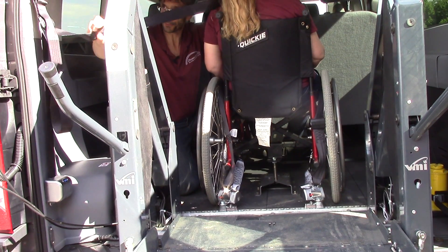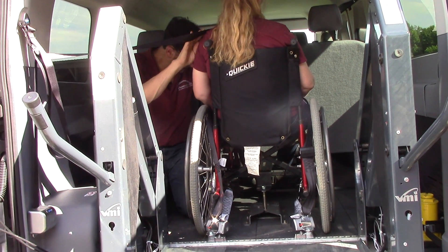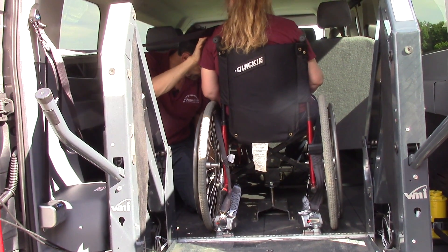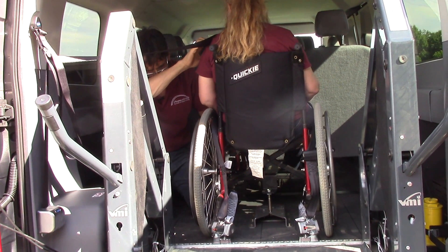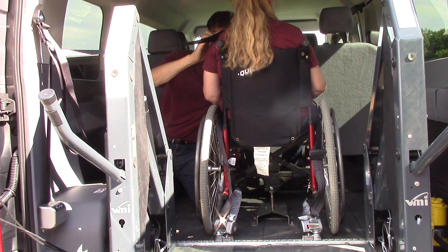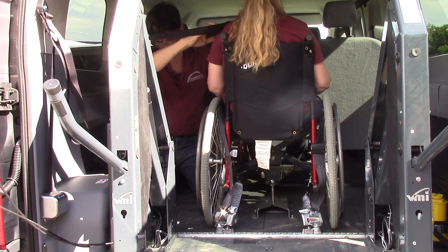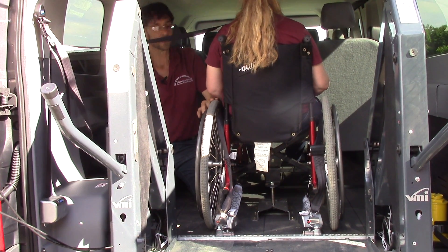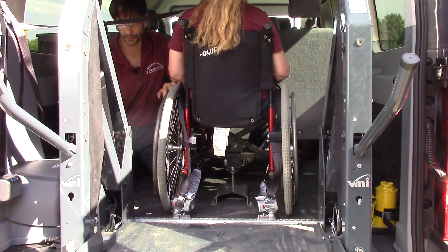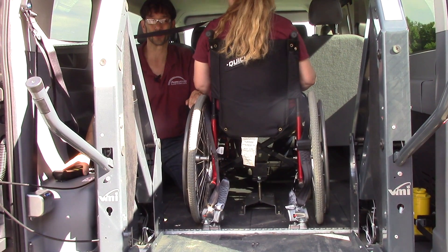Make sure that it goes properly over the shoulder and we're ready to go. You'll notice that we've got a retractable tie-down here, so the more we move it and pull it around, the more it locks in place. If you go forward and back you'll hear every time you do that you're getting an extra click and cinching it up even better. You're going to have to go around to the front of the vehicle to be able to close the doors. You can certainly close the wheelchair up, but you can't close the doors unless you've got door operators.